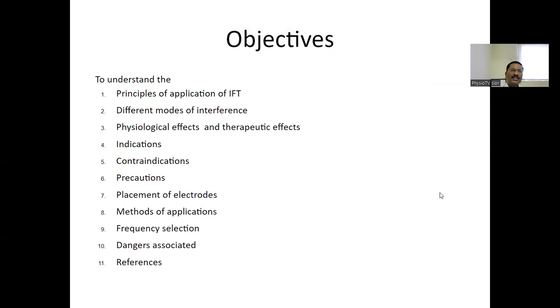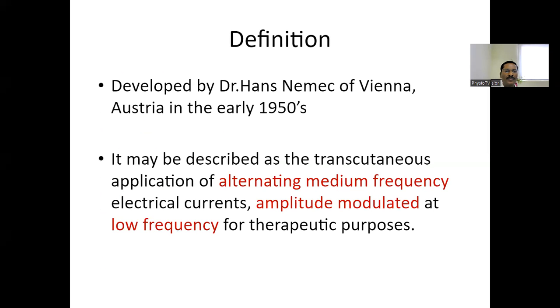Objectives of today's session are: first, the principle of application of interferential currents, the different modes in interferential currents, the physiological and therapeutic effects of interferential currents, indications, contraindications, precautions, the placement of electrodes, the methods of application, frequency selections, dangers associated, and finally we'll see the references.